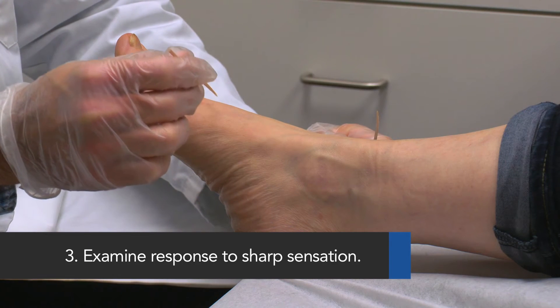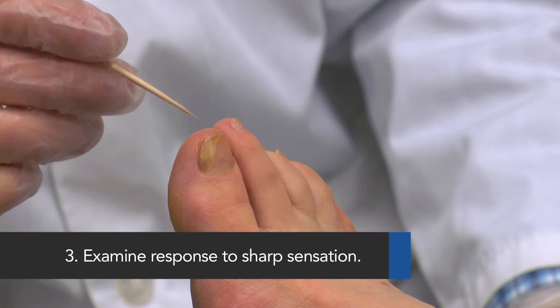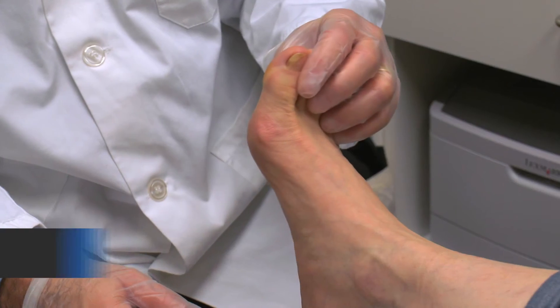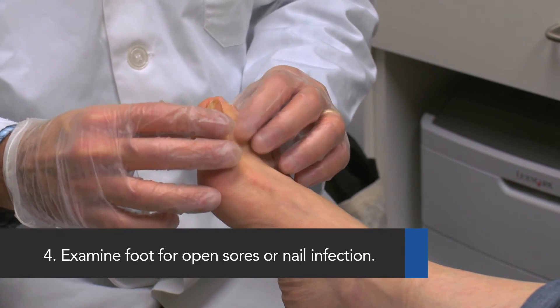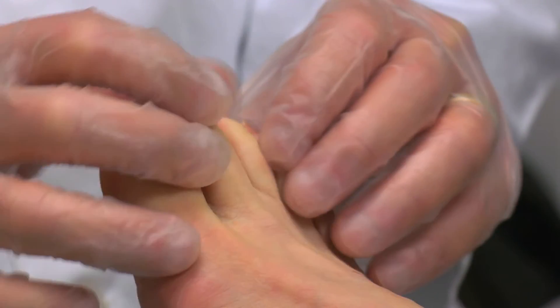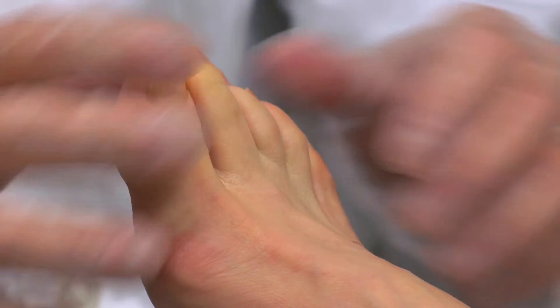Third, examine the response to sharp sensation by pressing on the foot and toe. Do not penetrate the skin. Finally, examine the foot, including between the toes, for open sores or nail infection. Do not treat a patient who has these.